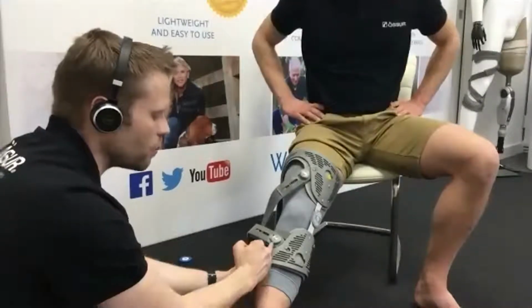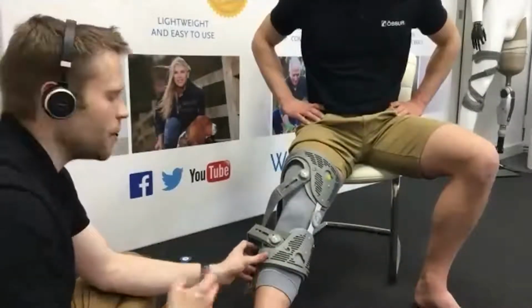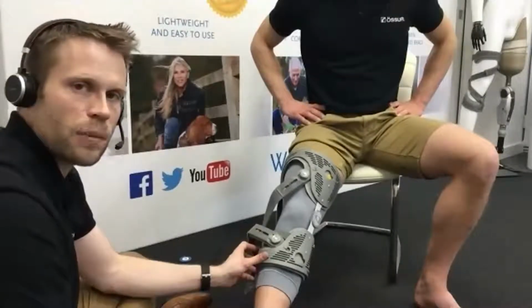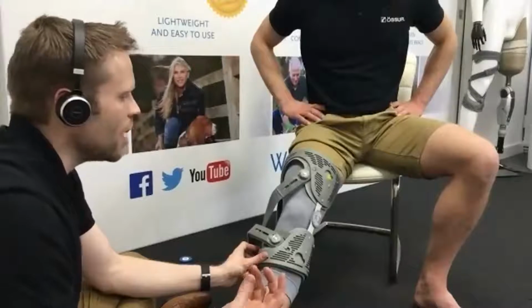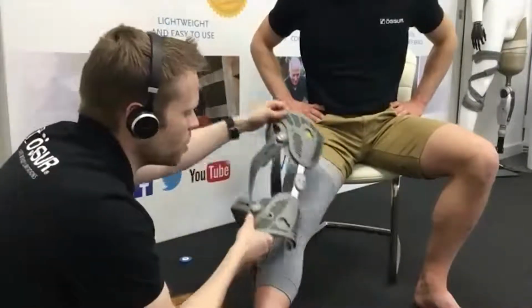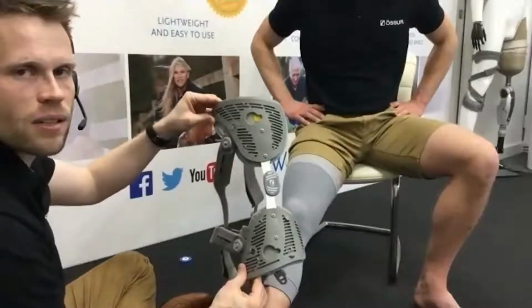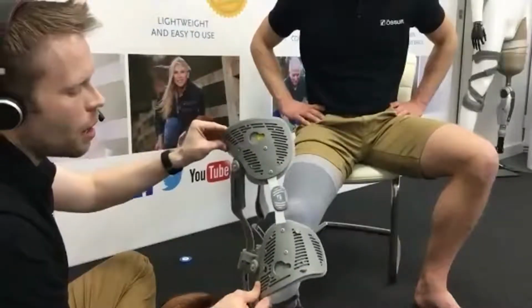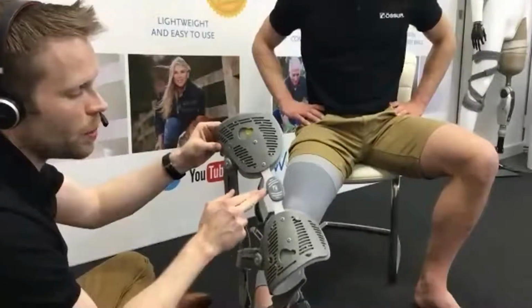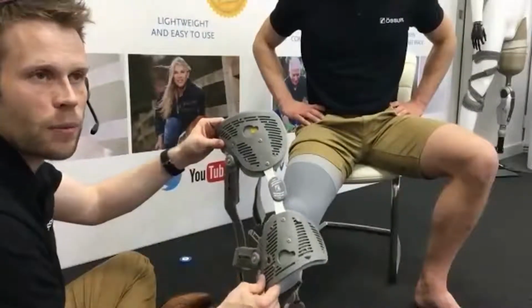Another area can be the tibial crest along the front there. So there's a couple of things to check with this, and that's normally to do with the hyperextension that the patient has. So very occasionally, the patient has got higher levels of hyperextension. You can see that the brace is designed to stop at 0. So it's sometimes necessary to adjust the stop in here just to allow a little bit of hyperextension.